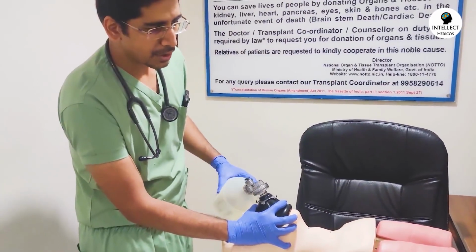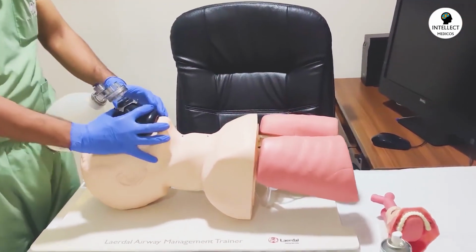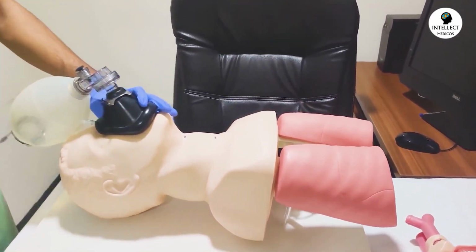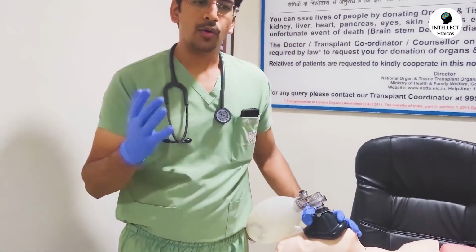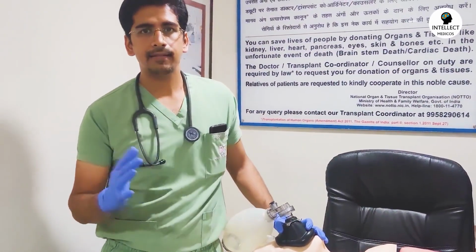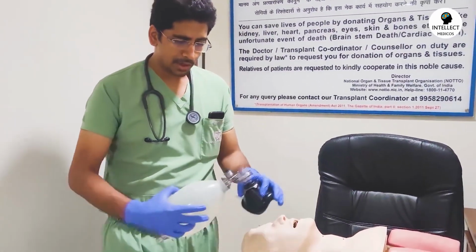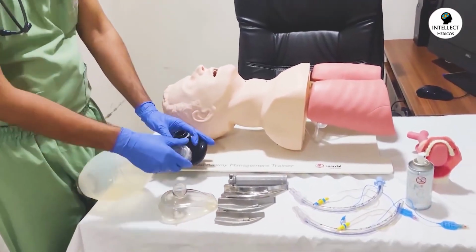And then with the other hand, you have to inflate. You have to give the breath to the patient. As you can see, the lungs are inflating, right? So this is how you do a bag and mask procedure. Now, whenever you are giving medication to a patient, till the time the patient is anesthetized and relaxed, you need to give bag and mask.